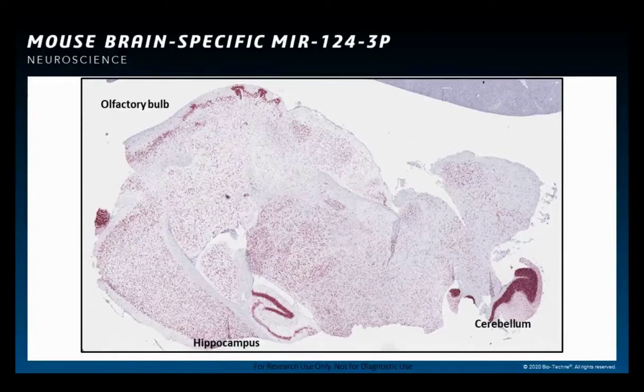Now, this particular microRNA is expressed in early development and continues to be expressed at very high levels throughout the animal adulthood. Now, miR124 actually plays a crucial role in supporting neuronal differentiation, and one way in which it does this is by targeting a particular mRNA called PTBP.